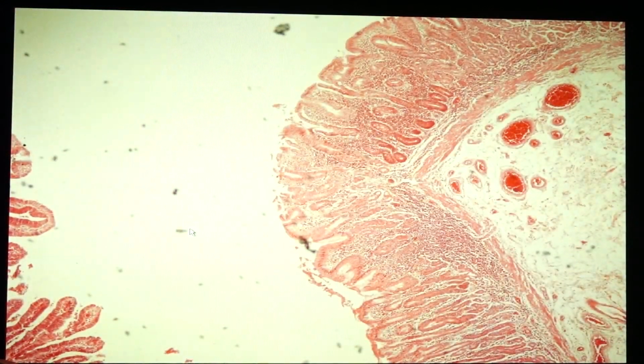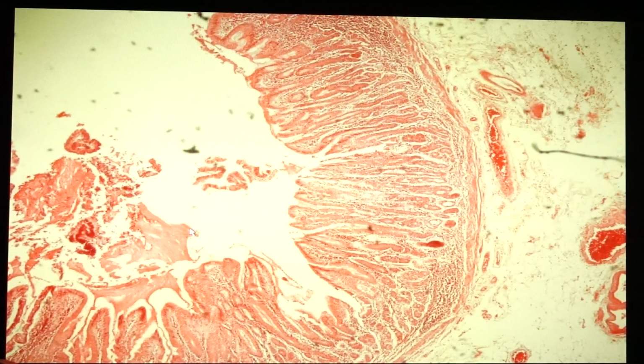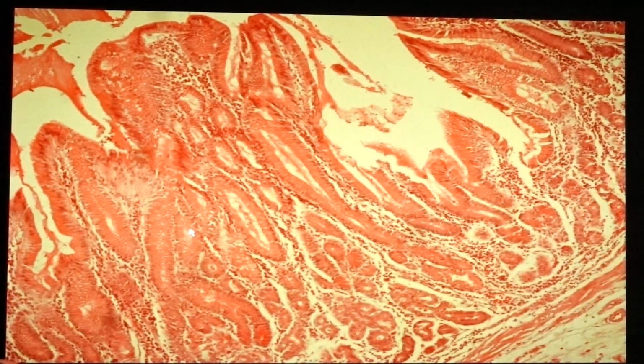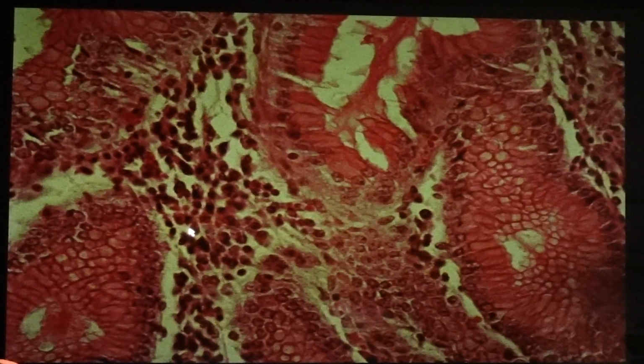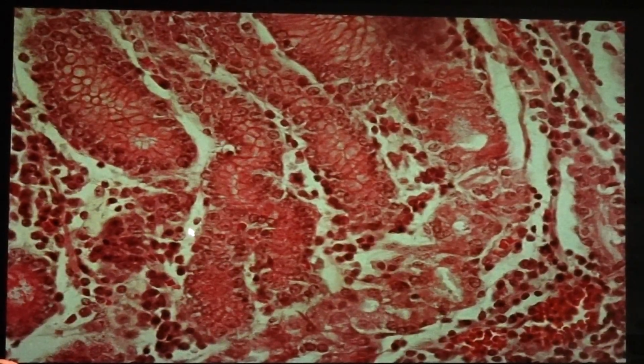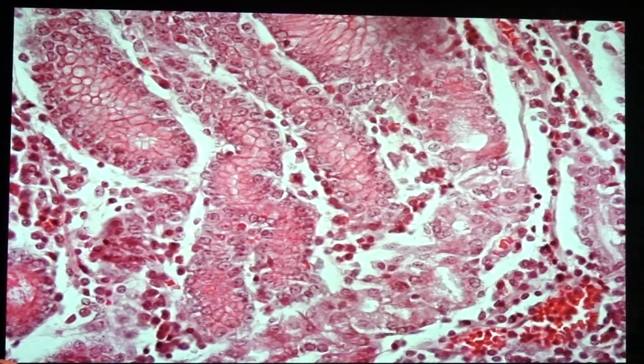Okay, so when you are dealing with the gastrointestinal tract, you always identify the location of the slide. In this case, you would see the presence of mucus-secreting cells, but they are not of the goblet cell type. So most probably this is coming from the stomach. And at the gastric glands, you do not see the presence of the parietal cells, and so this would mean that it is in the pyloric portion.